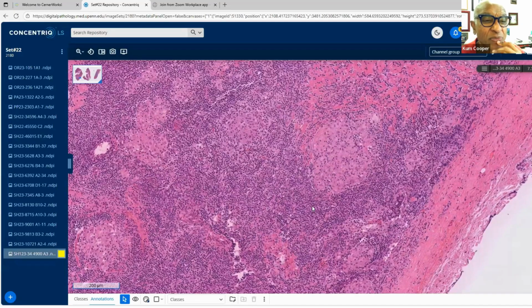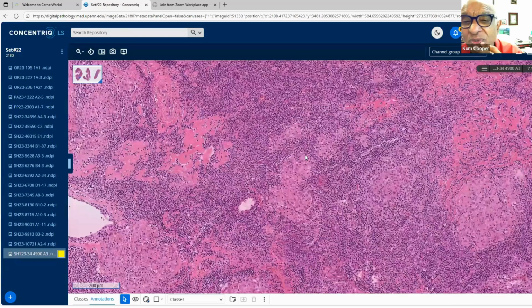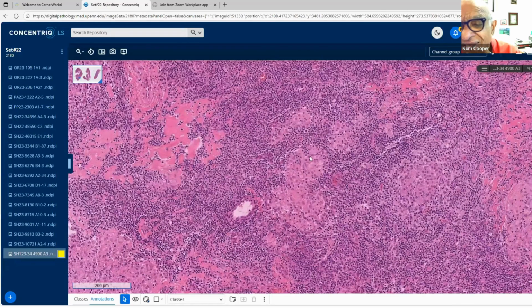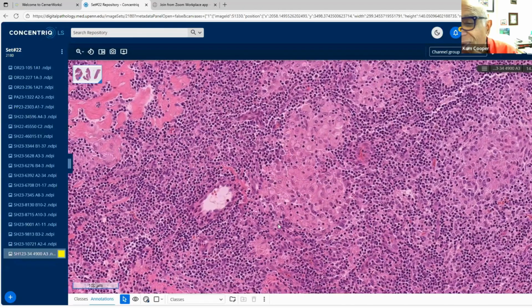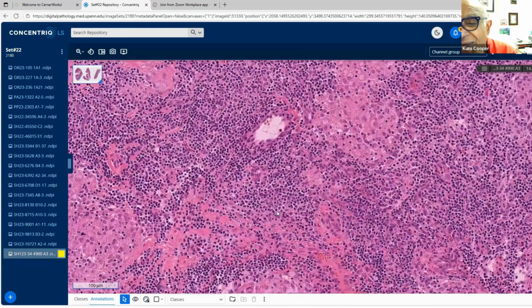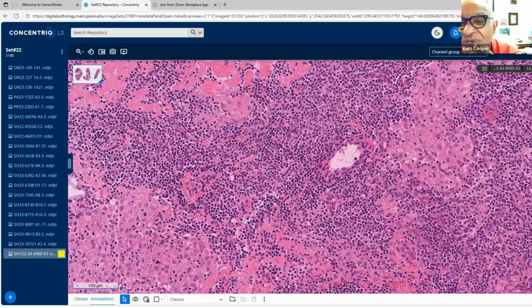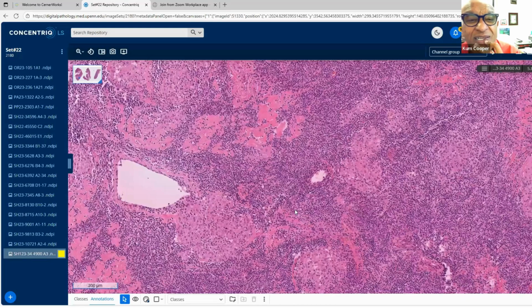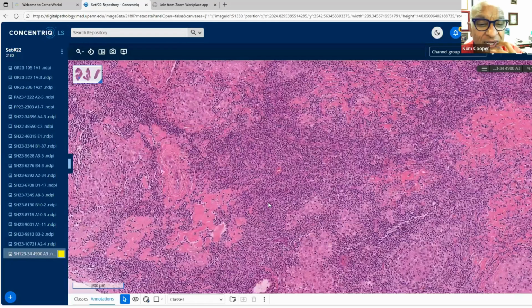Okay. So there's those pink structures, and then between those pink structures, in which you all know what they are, if you look carefully, and that's why I didn't want to do something so quickly, or try to do it quickly, because you cannot find what you're looking for.